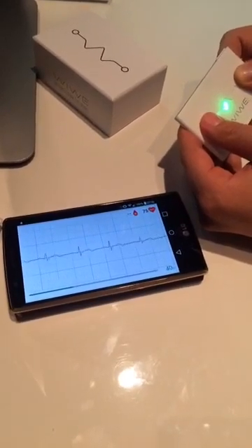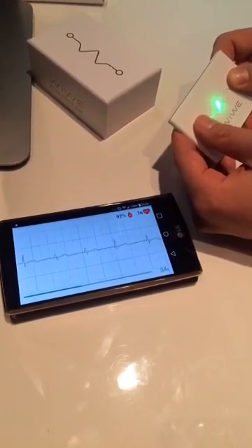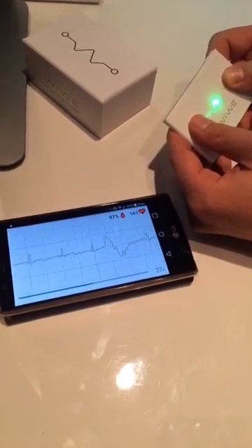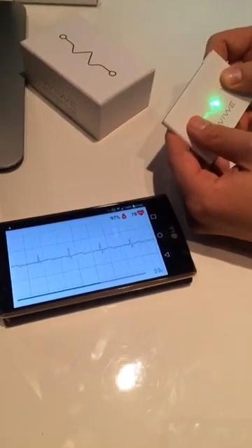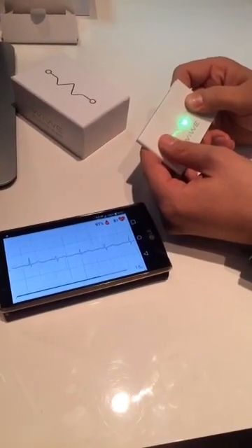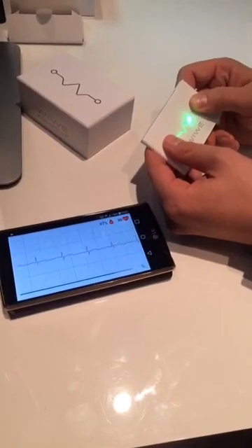My pulse is 75. I'm a bit nervous and excited about this reading. My blood oxygen level is 97% — above 95 it's all right, so I should be okay. Many devices can measure these things, but what I'm really interested in is what happens when it starts analyzing my EKG, what kind of things it can find, and how we can dive into the details of the EKG data. I'm a physician myself, but I don't analyze EKG on a daily basis, so it will be great to be able to dive into the details.